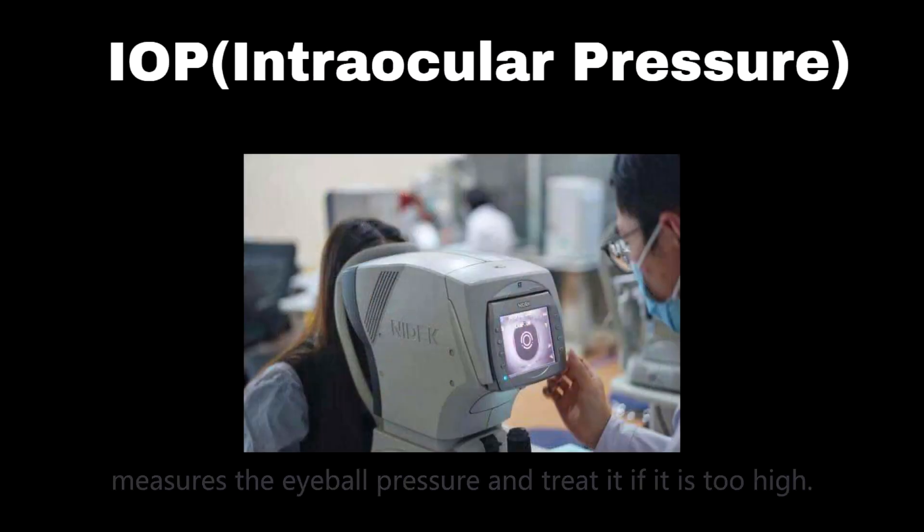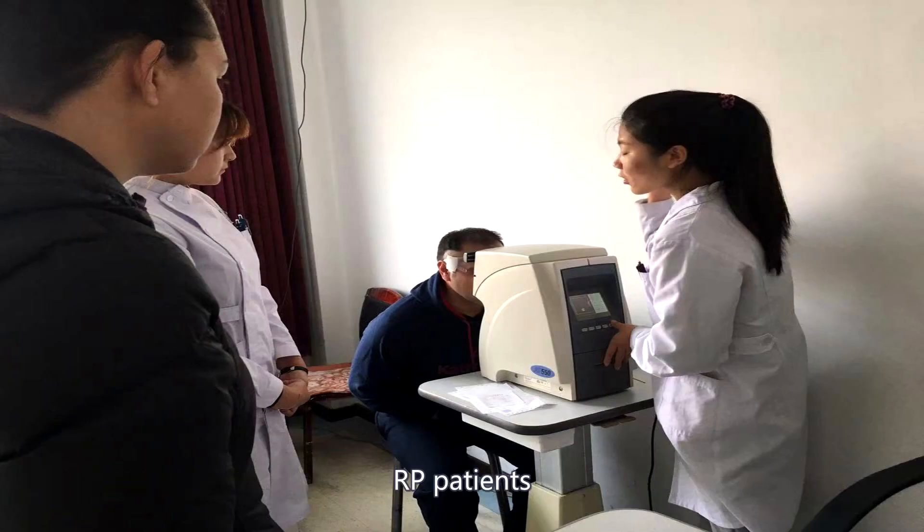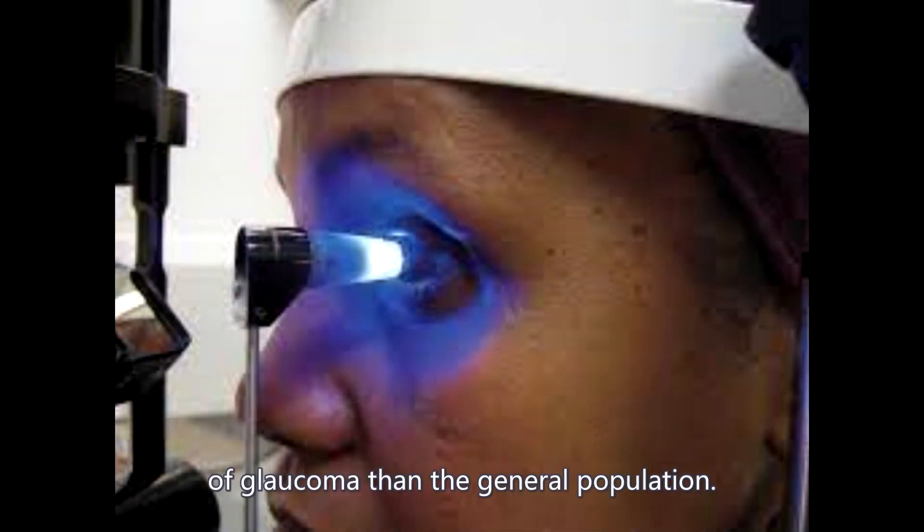IOP measures the eyeball pressure and treats it if it is too high. RP patients have a somewhat higher incidence of glaucoma than the general population.